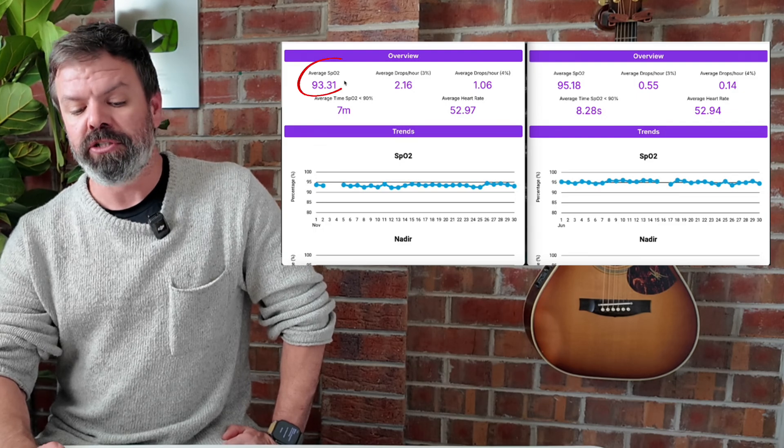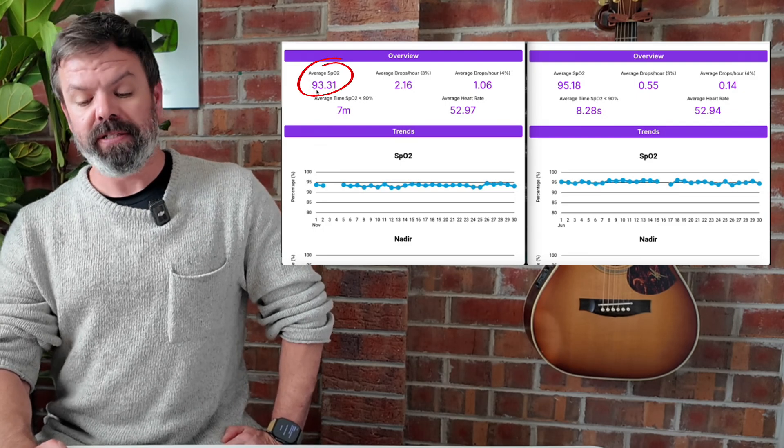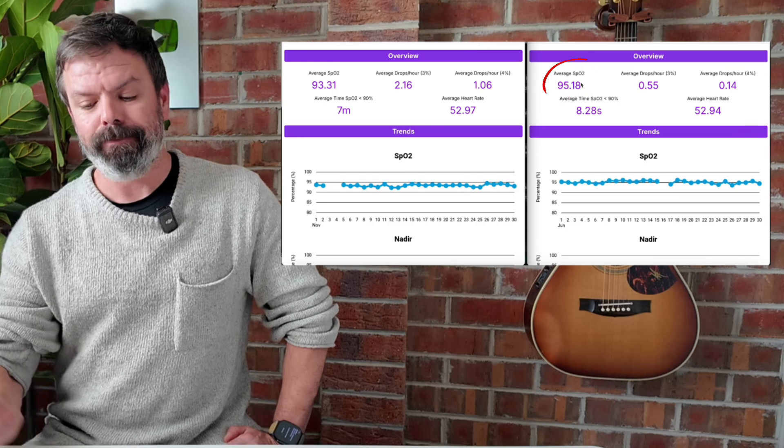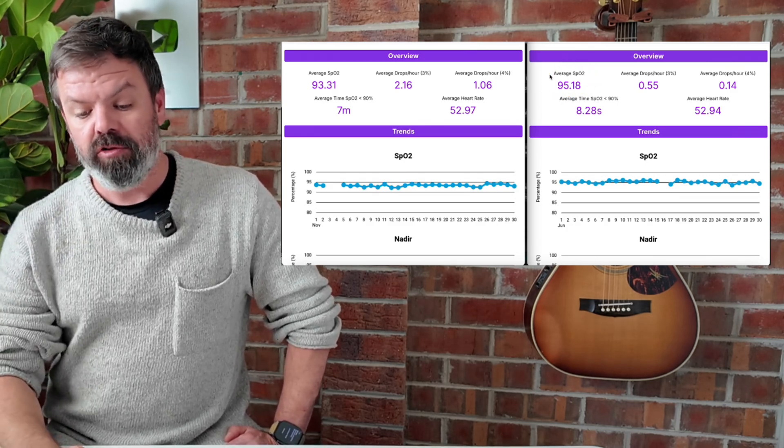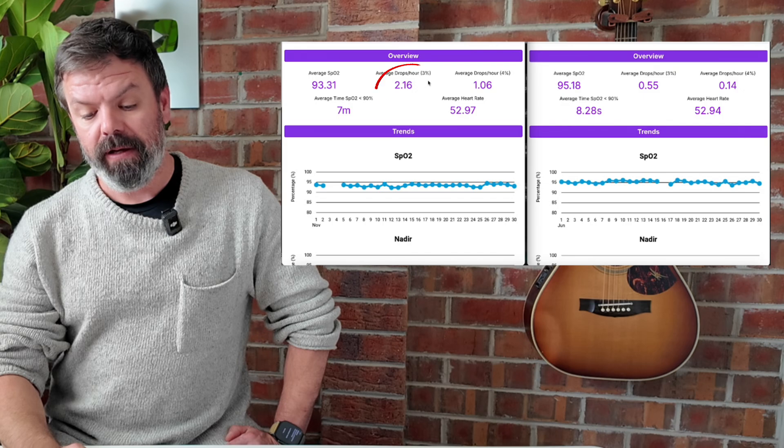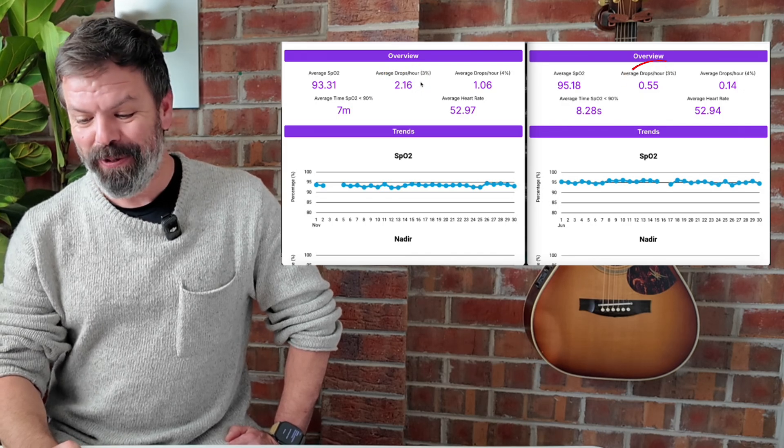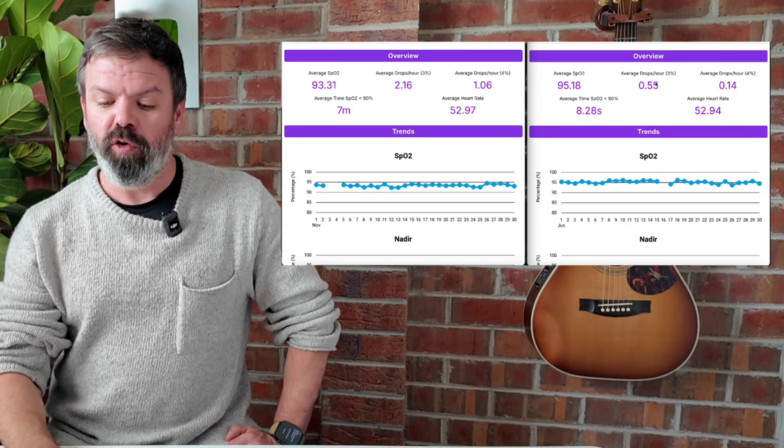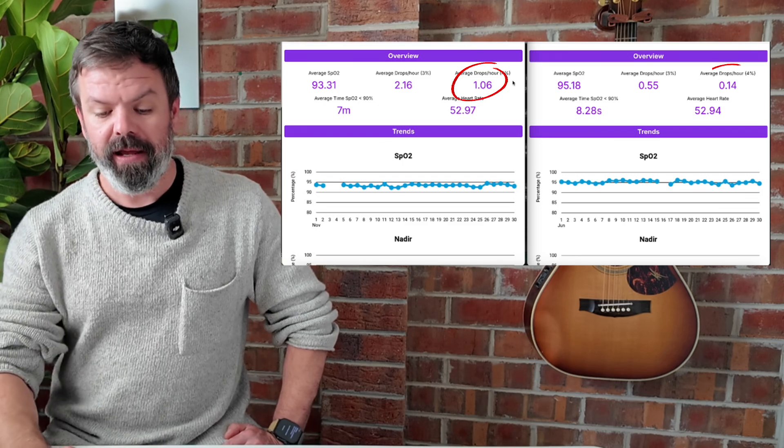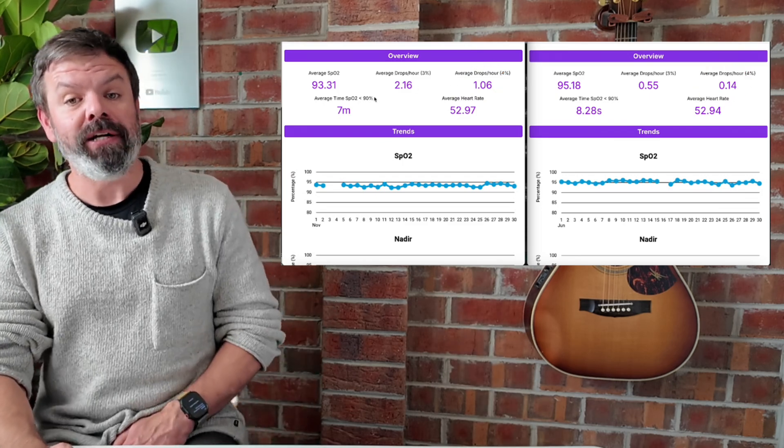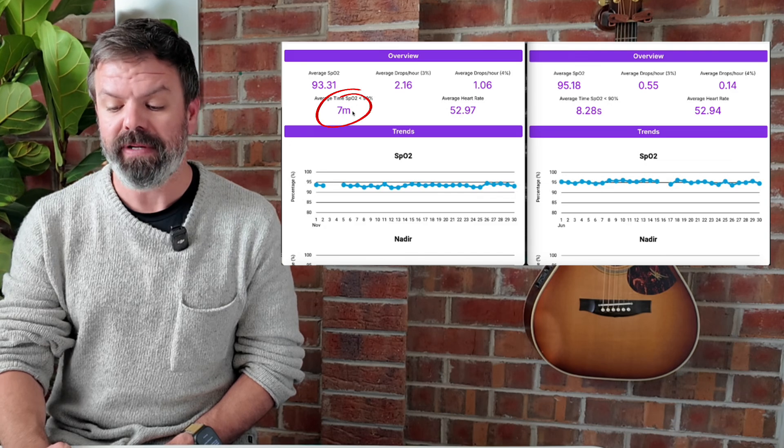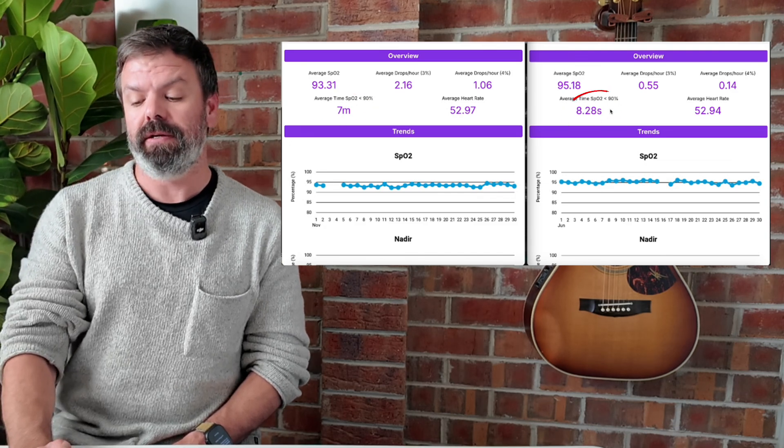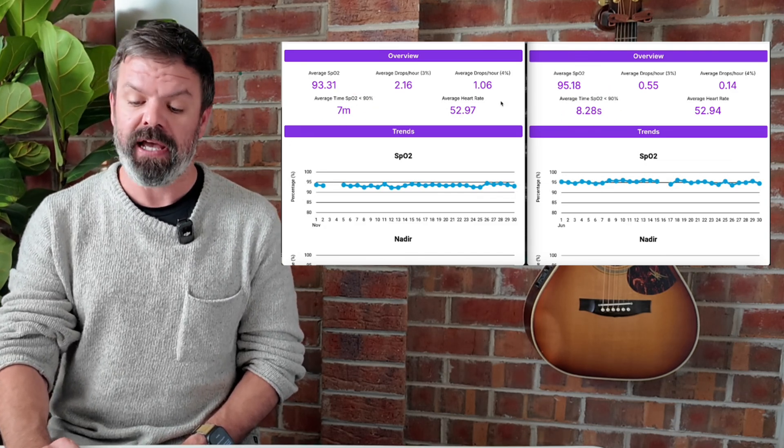Average blood oxygen has gone from 93% up to 95%. How good is that? Drops per hour has dropped from two to less than one. 4% drops, improved again. Time below 90%, used to be seven minutes a night. Now it's only eight seconds per night. And the heart rate is the same.